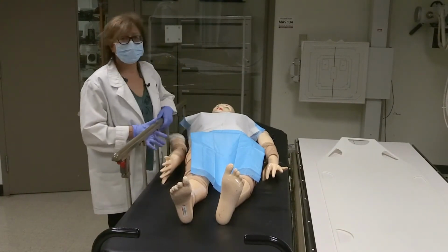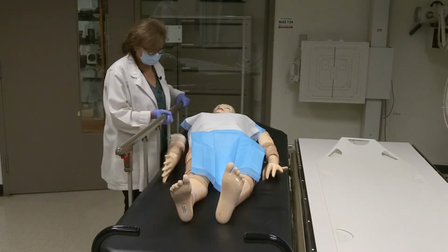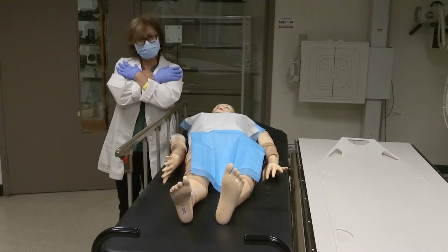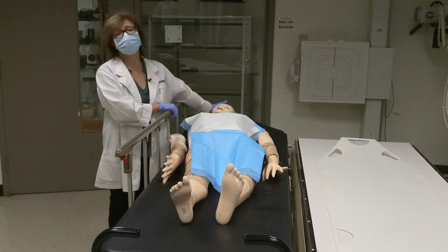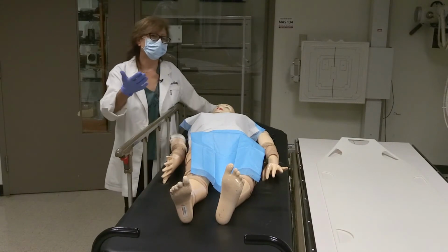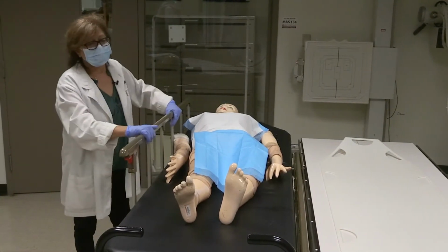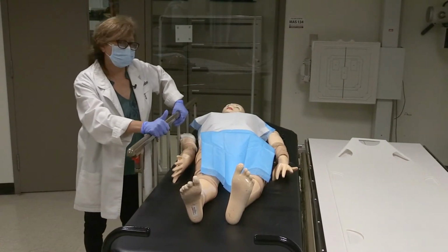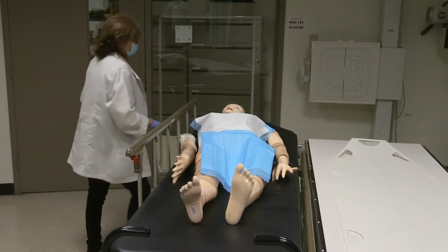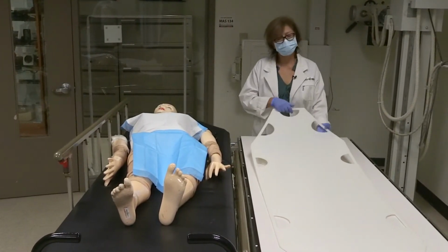If the patient needs total assistance, I will ask the patient to cross their arms on top of their chest. I'm going to remove any pillows that are under the patient, and then I will call for additional moving help. There are two ways of transferring a patient from a stretcher. One of those is using a device called the smooth mover.